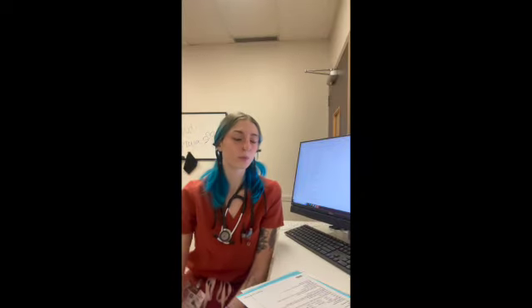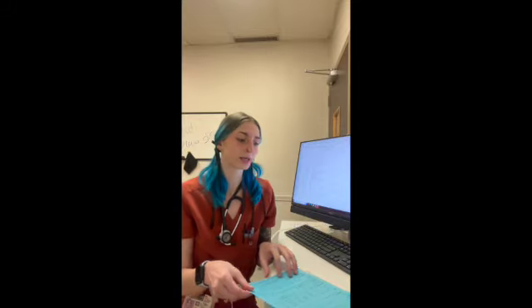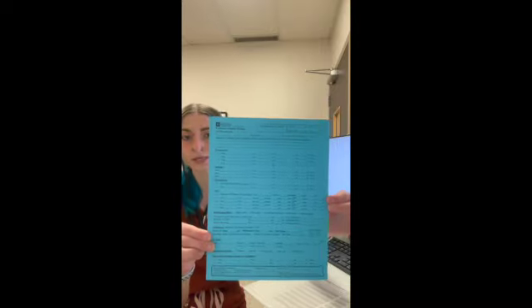We would not begin anything on our patient until we got our blood work back, just to ensure that there's nothing abnormal, everything is functioning correctly, and all of the values are within normal limits. Once we get our blood work back, our anesthesia team will start developing our anesthetic protocol. Here is our anesthetic protocol sheet. They are blank. You will begin filling out your patient information once your patient's blood work has been brought back.